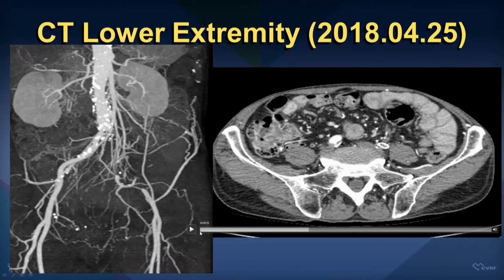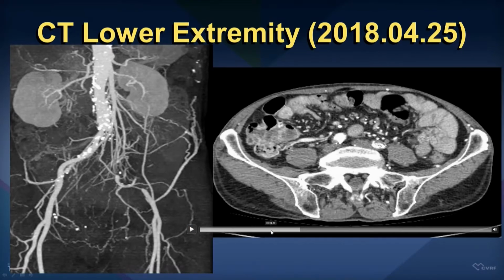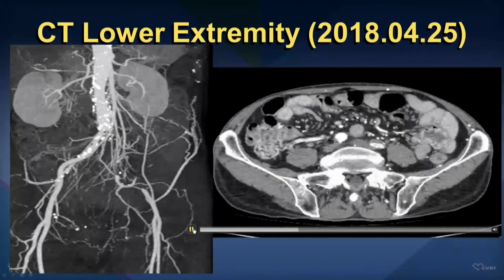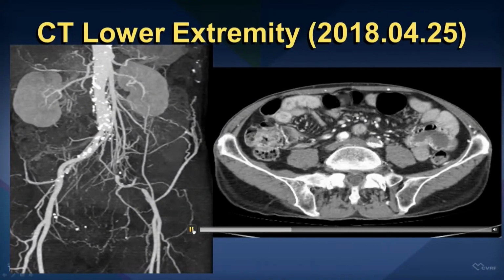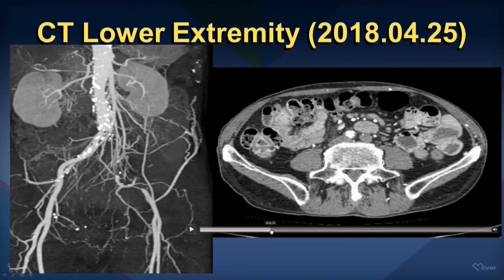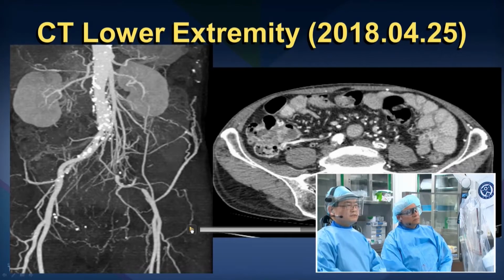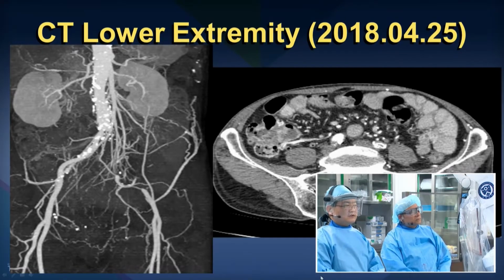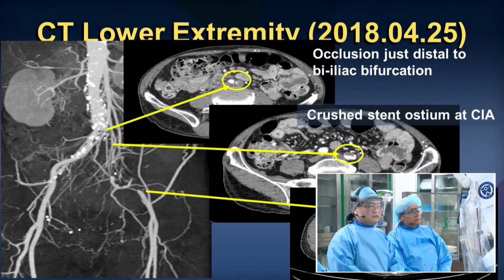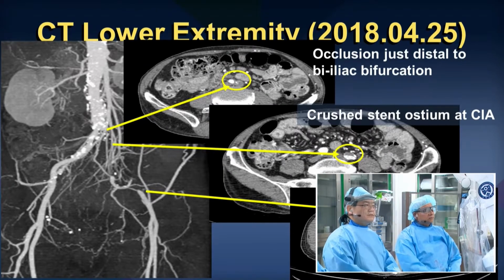Panelists, Dr. Bob Burson here, it's a great case. First thing I note, 6 years after the initial implant, the degree of atherosclerosis has progressed in the aorta and the contralateral iliac. That suggests this patient has a very aggressive atherosclerotic process. I wonder if he's a continuing smoker. Stent compression could be because the stent was always elliptical.